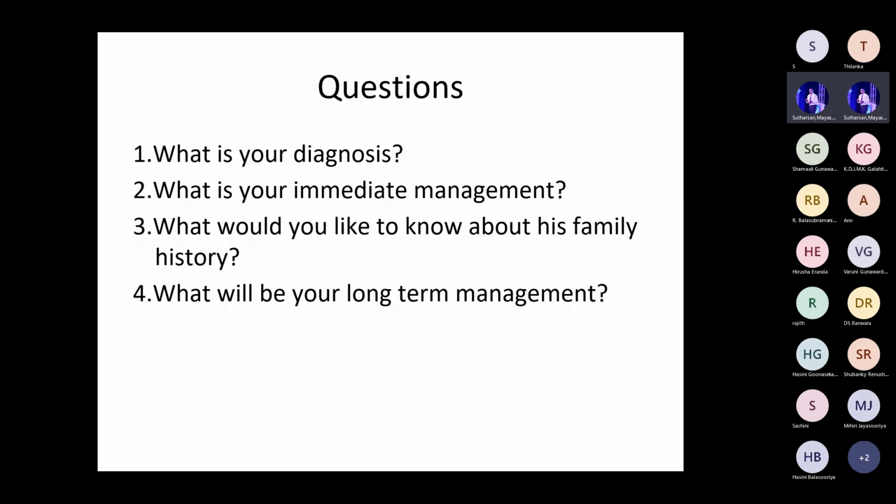What is the immediate management here? It's a pulseless VT. What kind of shock? Who said synchronized? Asynchronized. Only in SVT do you use synchronized. Asynchronized DC shock. So in the family history, what do you want to know? That's very important. Family history of sudden unexplained death, especially among young people.